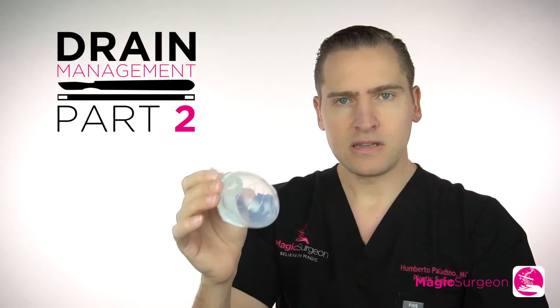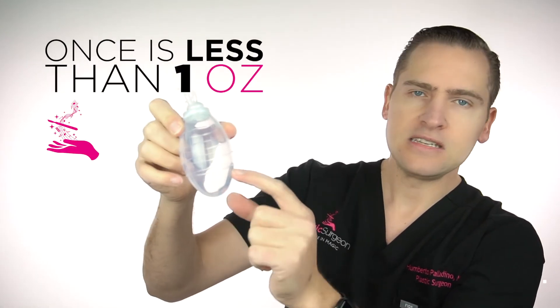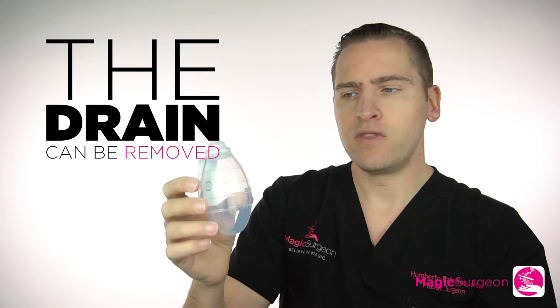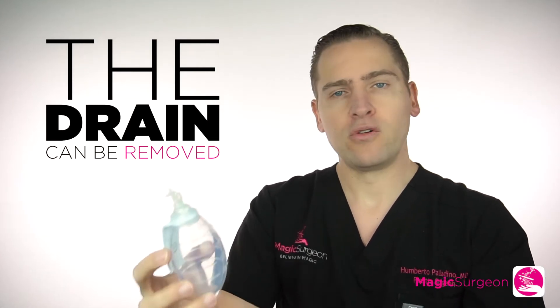It's very important that once the output of this drain is less than 30 cc's — 30 milliliters, or one ounce — in the whole 24 hours, for one or two days, then the drain can be removed, because the body can handle that amount of fluid and will reabsorb it on its own. It doesn't need the drain anymore.